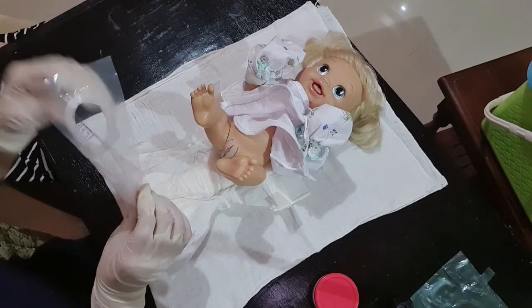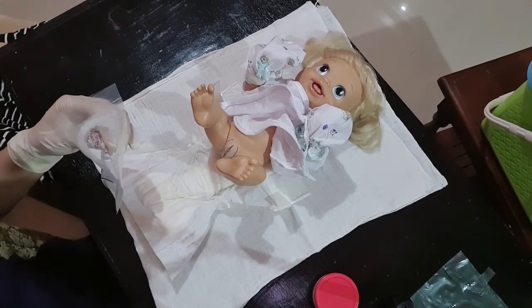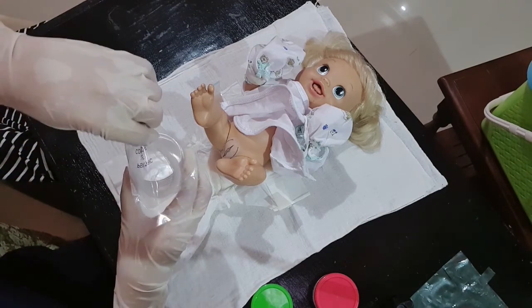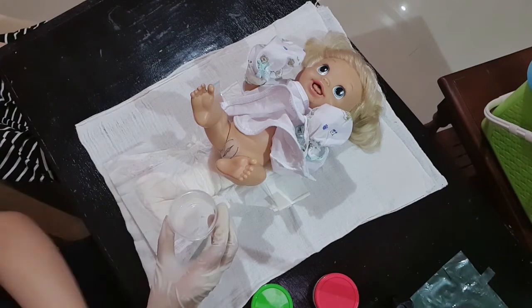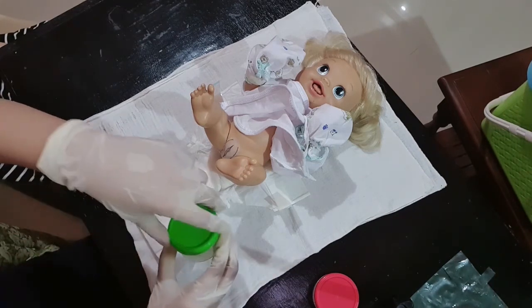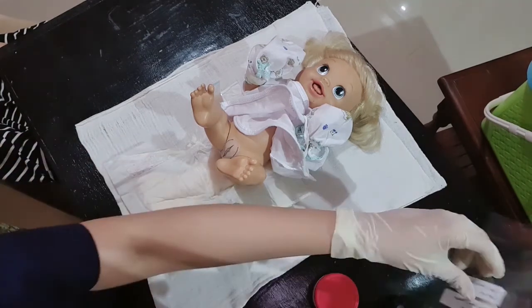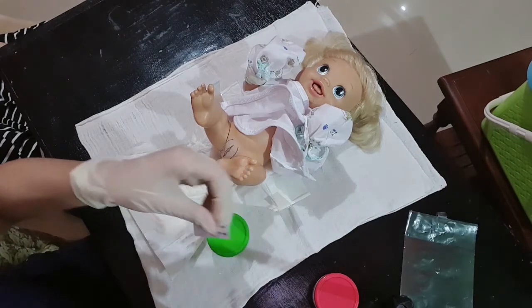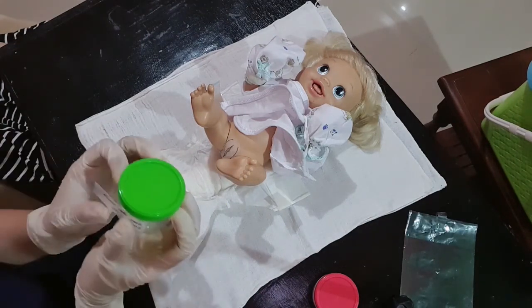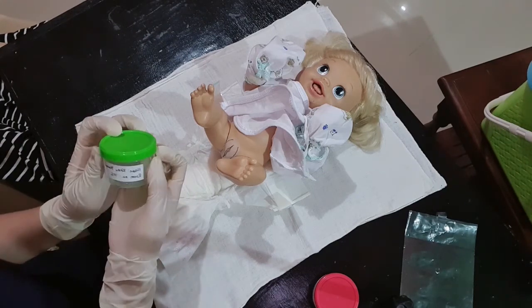And I will transfer the specimen to an appropriate container. I will be placing a sticker on the body of the container, which includes the name and the room number of my patient.